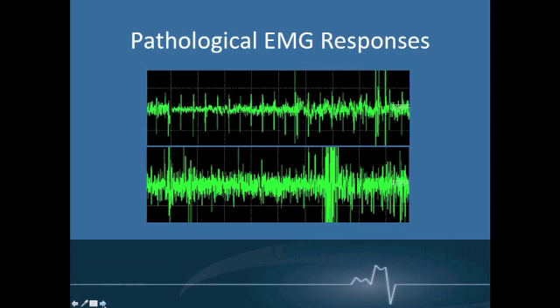And then, similar to your spinal EMG, we could talk about pathological responses, and it's the same criteria. Bursting or training, training or neurotonic discharges are pathological. Bursting and spiking are often actually informative. So during a parotid especially, the surgeon knows they're going to be near the nerve. It's going to be unavoidable. So having that audio speaker on and then hearing the short bursts that occur when they go near the nerve, that's useful. That's not pathological. That tells them, hey, I'm near the nerve. I know I am, and I'm going to keep listening to this because this gets a little worse. I know I'm getting a little too close or I'm aggravating it too much.